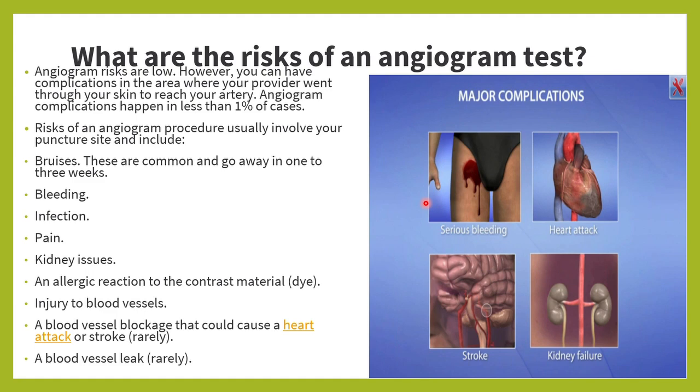What are the risks of angiogram? See, the risks of angiograms are low. It is a minimally invasive procedure. There would be complications in less than 1% of the cases. It could be some amount of bleeding, or there could be infection, pain, some kidney issues due to contrast, and an allergic reaction due to the dye, or sometimes you might even have a heart attack. So these are a few of the risks of the angiogram.